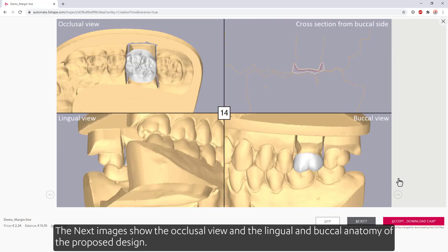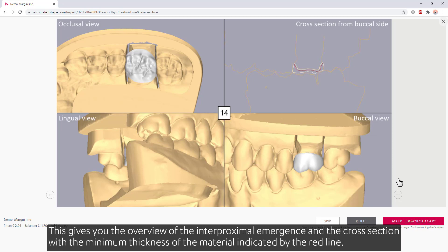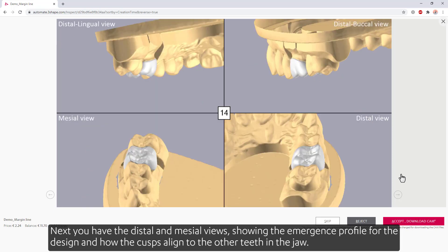The next images show the occlusal view and the lingual and buccal anatomy of the proposed design. This gives you an overview of the interproximal emergence and the cross section, with the minimum thickness of the material indicated by the red line. Next, you have the distal and mesial views, showing the emergence profile for the design and how the cusps align to the other teeth in the jaw.